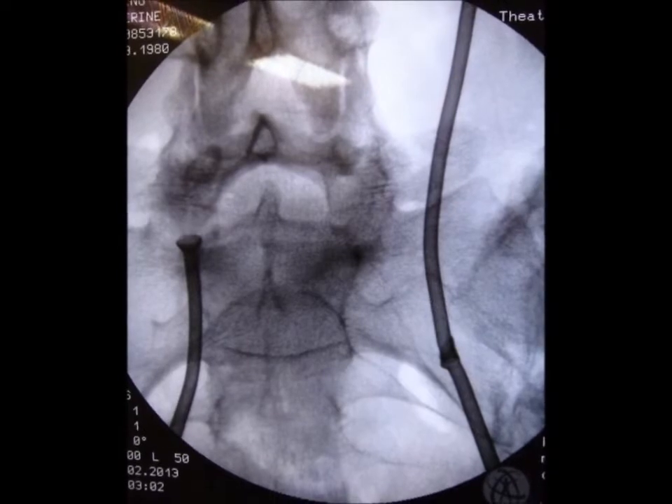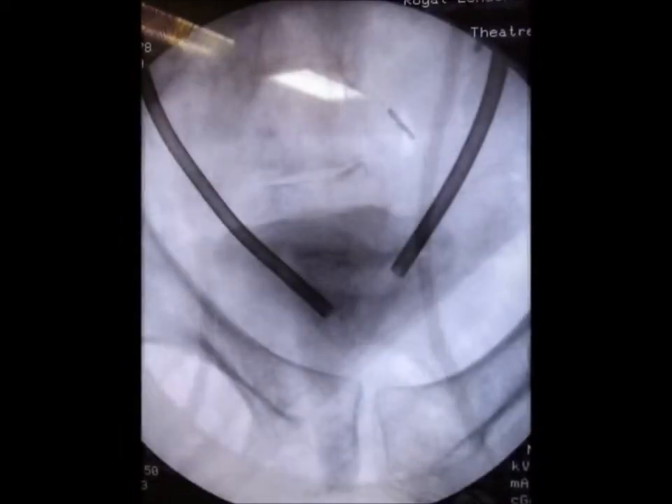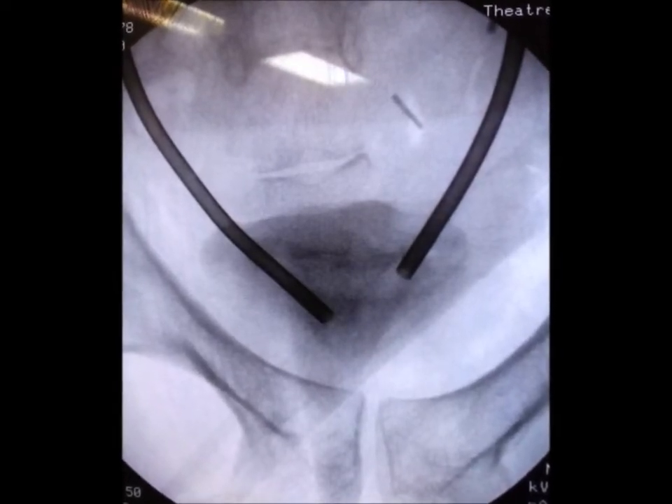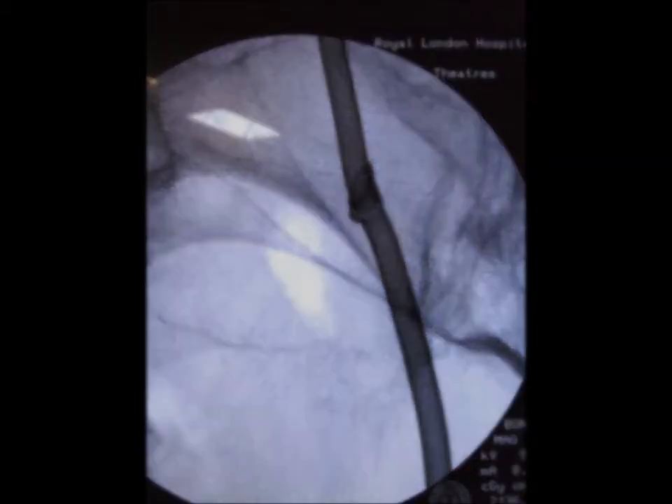Both MAMOCATs now bridge the ureteric orifices but do not protrude significantly into the bladder, which could cause stent-related lower urinary tract symptoms. The straight end of the proximal stent fits perfectly into the funneled proximal end of the distal stent. From previous insertions and endoscopic follow-ups, we know that this fit does not allow tissue ingrowth, nor does it lead to increased infection or encrustation at that particular joint.